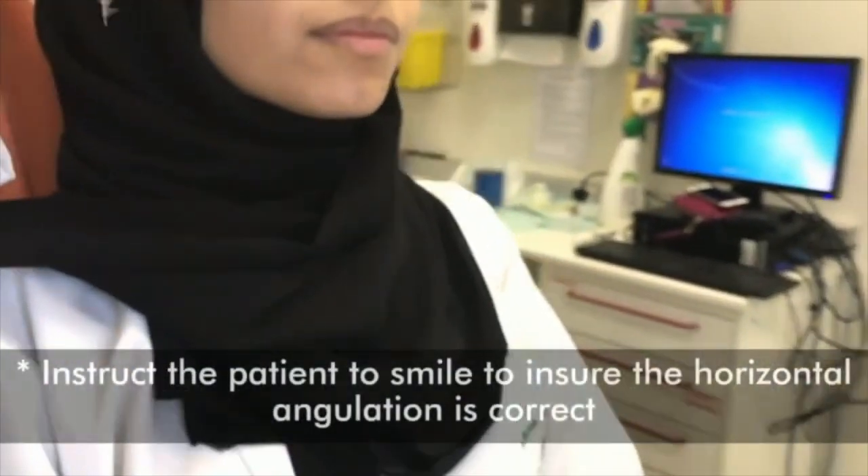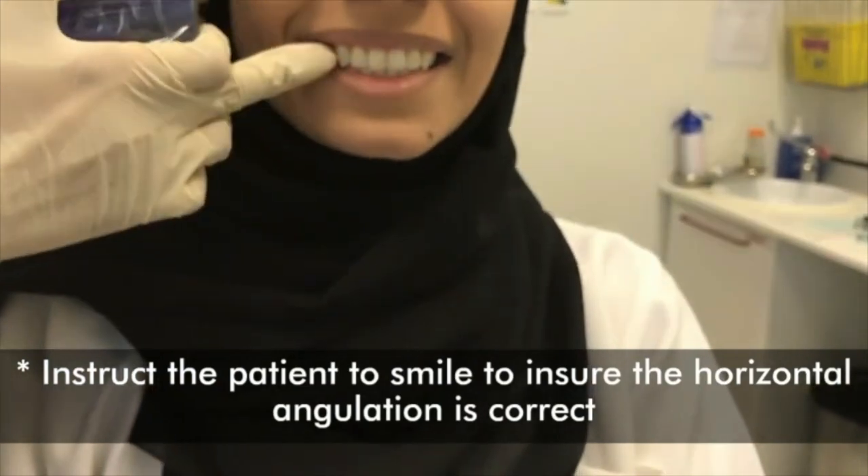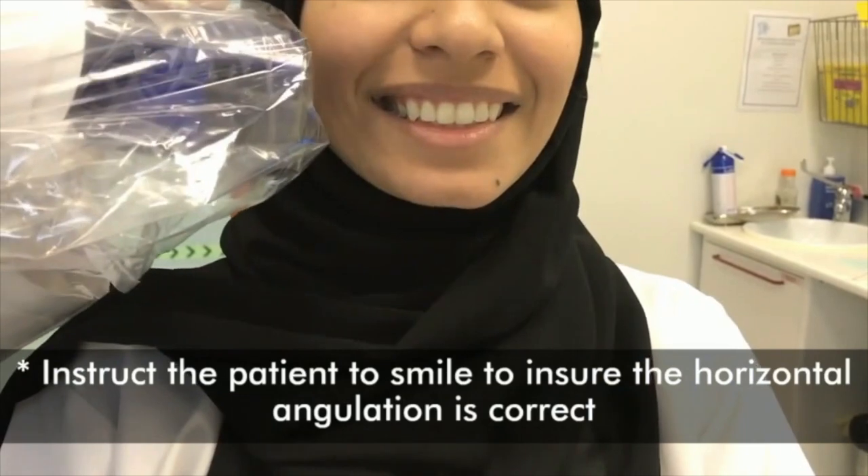Adjust the horizontal angulation of the x-ray tube head by directing the beam through the contact points at right angles to the teeth and the film. The vertical angulation is always 5 to 8 degrees downwards.